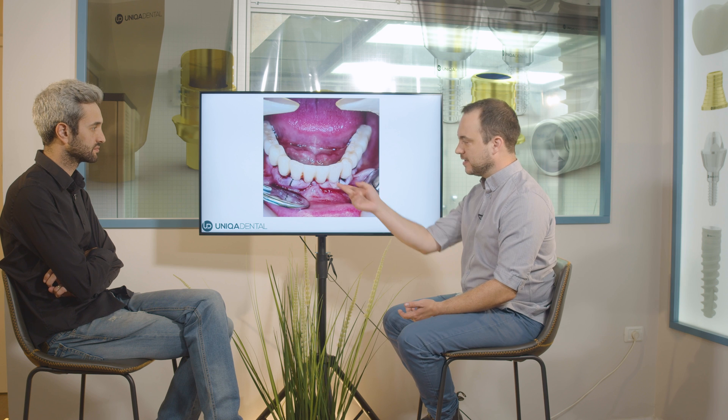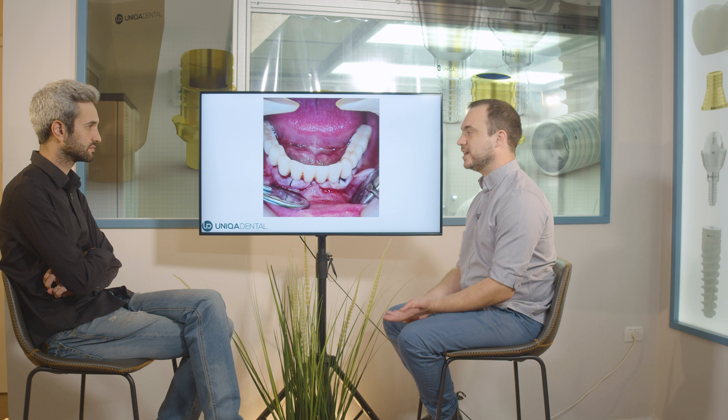Now we have the osteointegration, and what we want to do is take impressions on those osteointegrated implants. At the same time we can extract both of the canines and add an implant or two in the frontal area. This way, there is no moment where the patient goes without teeth. In a week we'll take out the stitches, maybe remove the bridge and return it to make sure everything is fine — there is no aesthetic problem. The patient, as before, was with the same bridge for a couple of months, then we load all the implants, place another implant or two, and extract the canines that wouldn't allow us to mount the bridge.